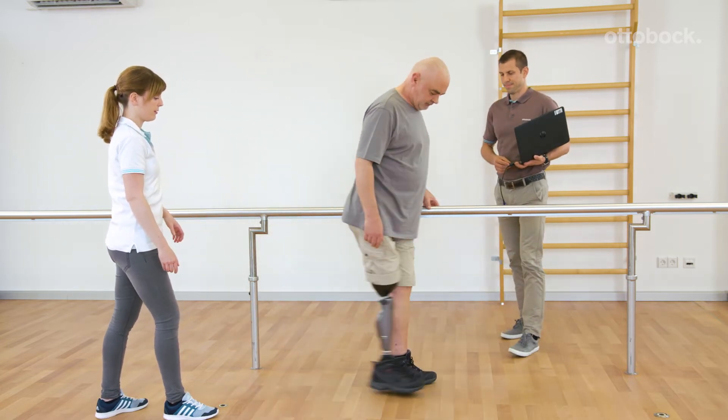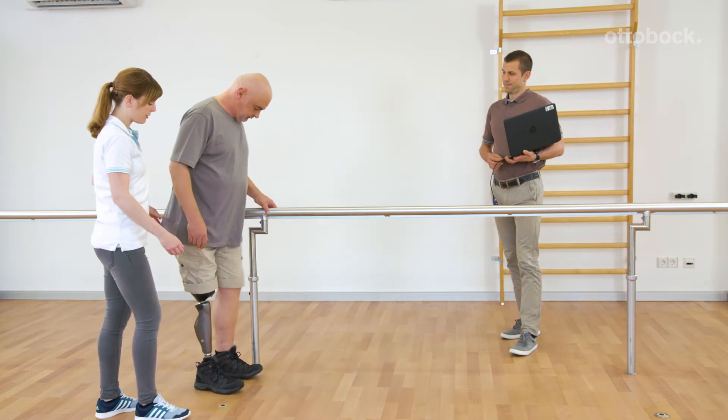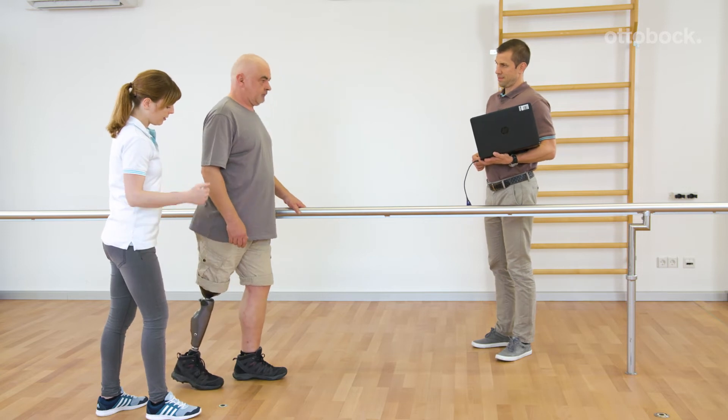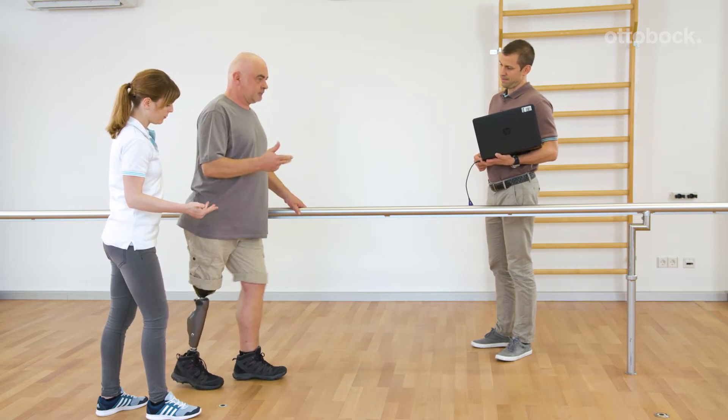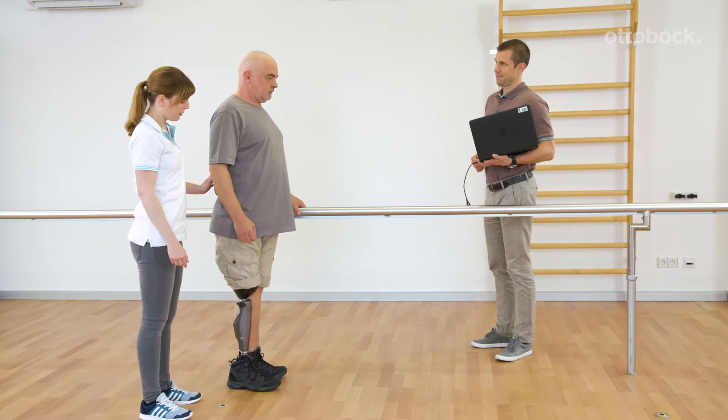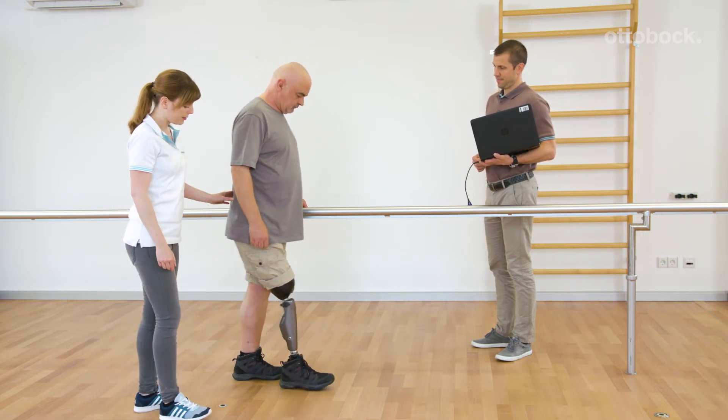Direct switching between the two MY modes is not possible. The second MY mode requires four times bouncing on the forefoot. Three beeps confirm the switch to the second MY mode.